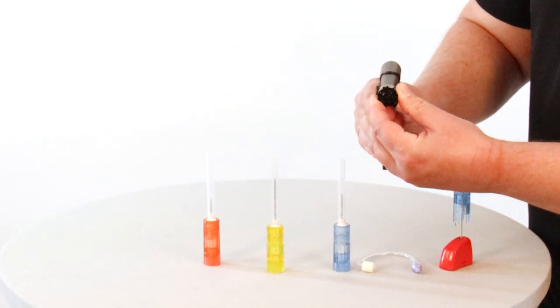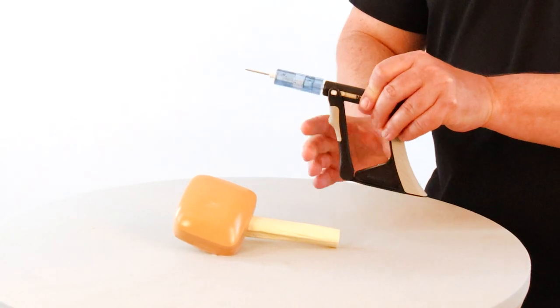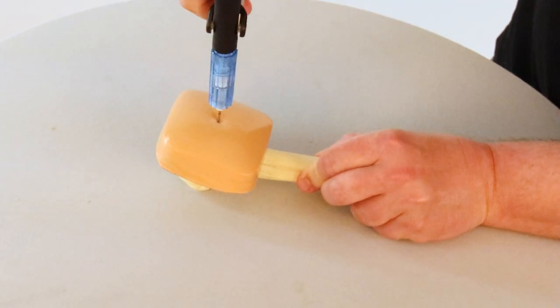Catheter placement is achieved by repeated trigger actuation that creates a rotational spin. Continual actuation combined with gentle downward pressure results in simple I.O. placement.